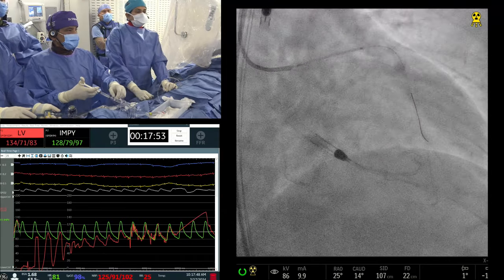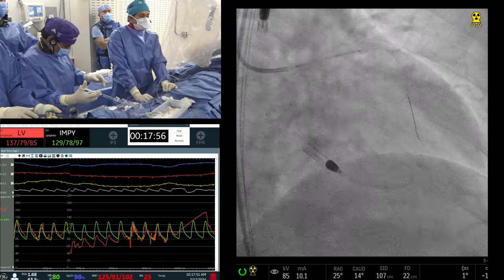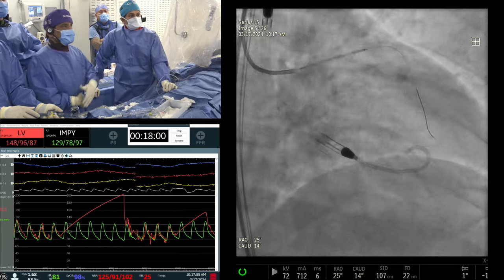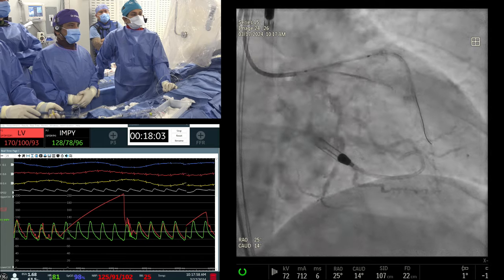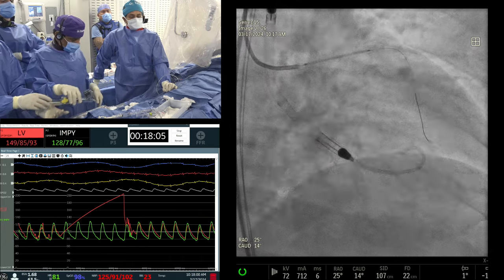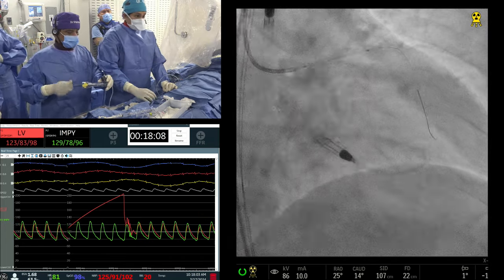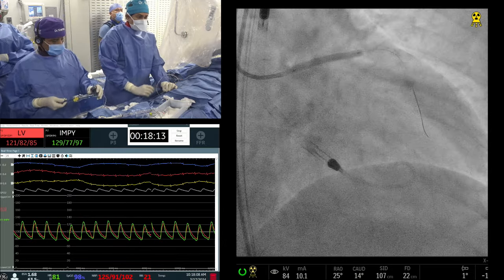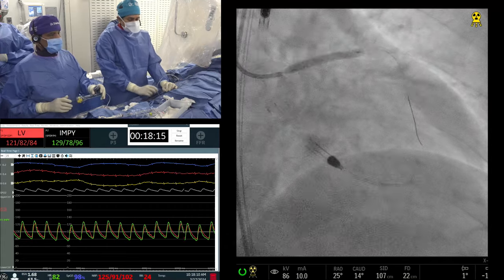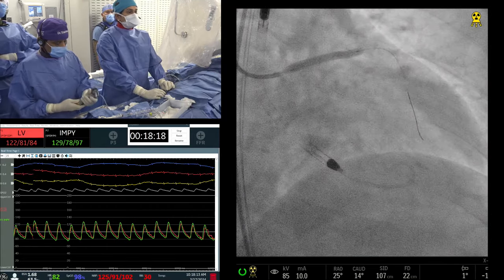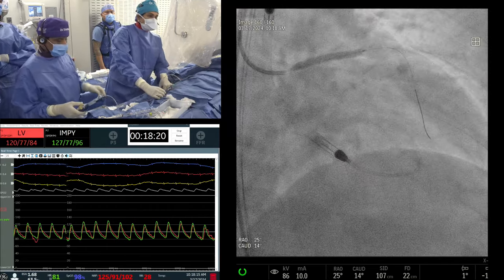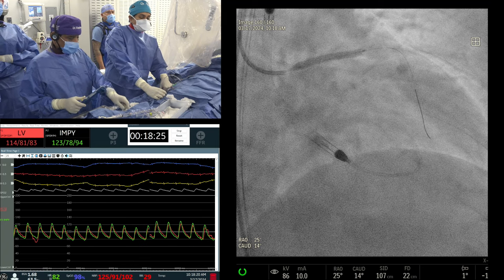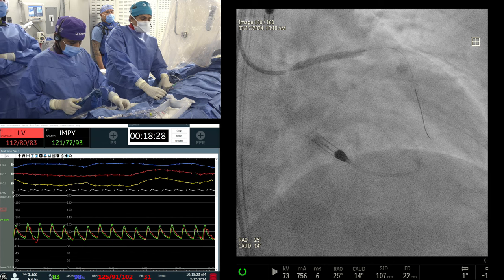Today we have a creatinine of 0.7. We still believe in using dye rather than non-dye OCT. The number one criteria here at Sinai — we do about 300 unprotected left main per year — every left main is done with imaging. Otherwise, we are OCT-driven, especially for understanding calcium.